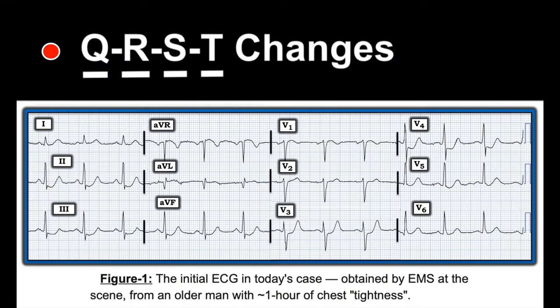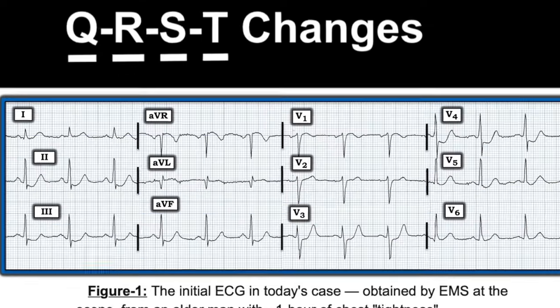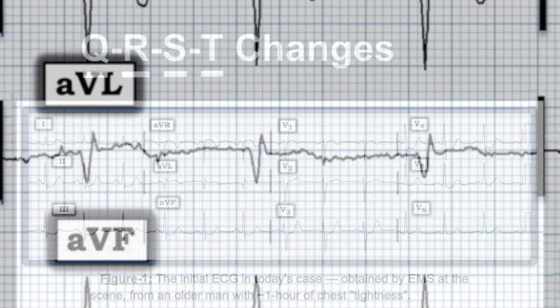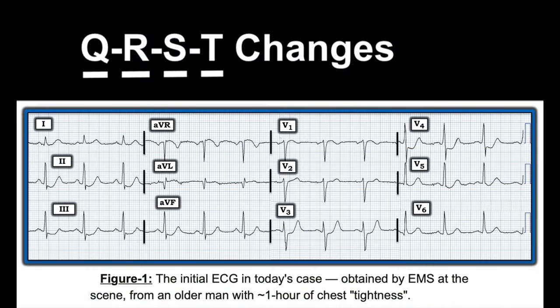Now we are up to QRS-T changes. Are there any Q waves? Lead AVR doesn't count since it looks away from the heart. But there is a really large, wide Q wave in one lead — especially notable given the small R wave. Looking at all other leads, it is the only Q wave. For R wave progression, the R wave gets progressively taller and exceeds the S wave between V3 and V4 — that is normal progression.